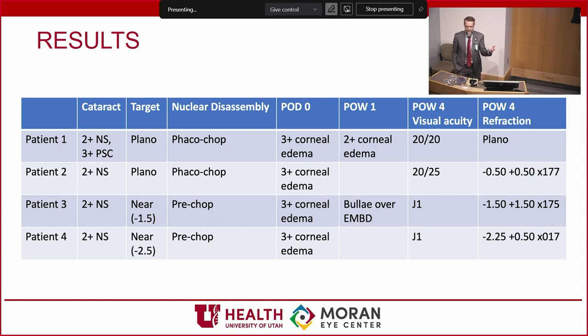They do have an app that you can read out what is your cumulative amount of time in that position 2 equivalent, your position 3 equivalent, but really the thing that they're measuring, and this is what Zeiss is really touting, is this decreased fluid use. This uses less fluid than phaco. This is the bag, and for an entire case, it will be between 15 to 30 total ml that goes through the eye. So there's not a lot of fluid going through the eye, and we already know, however, that doesn't necessarily affect endothelial health.